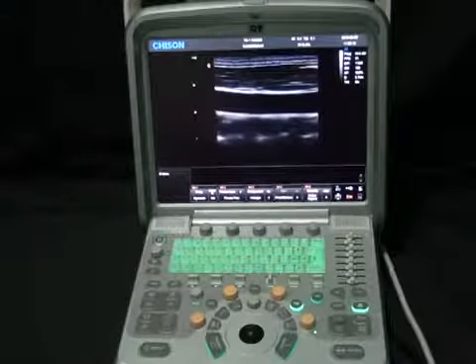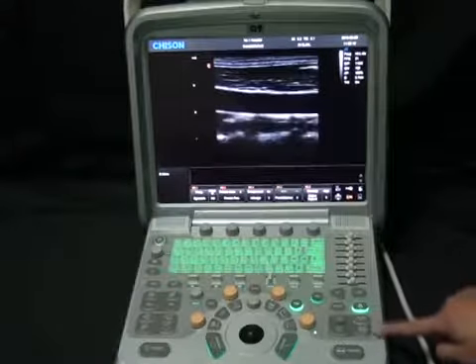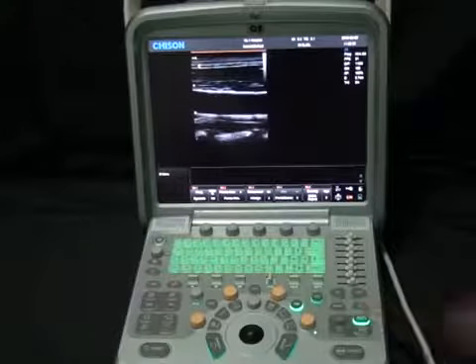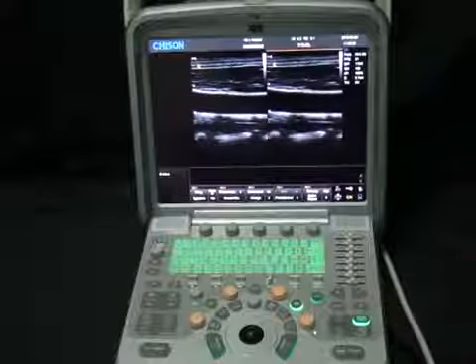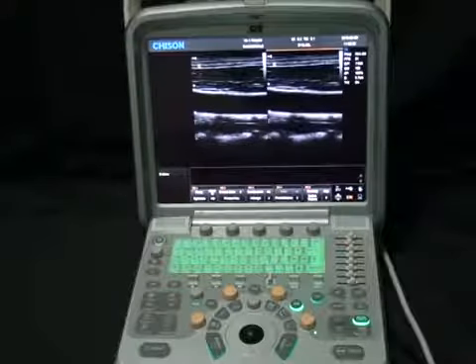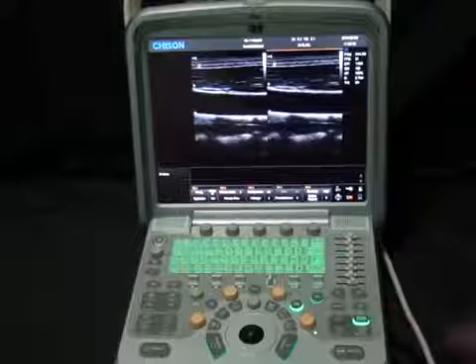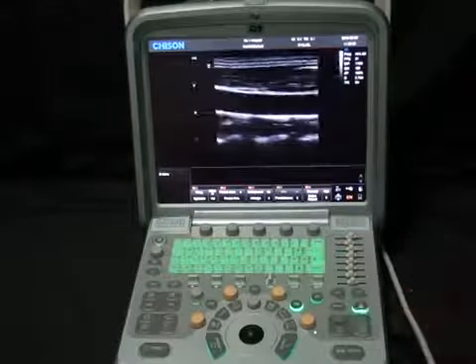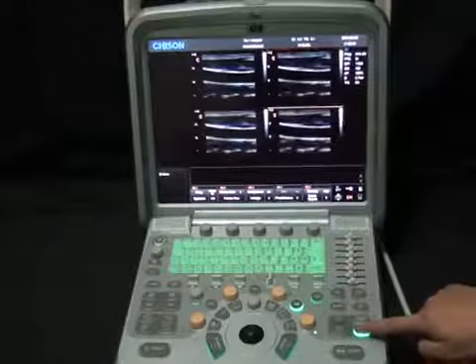It is worth mentioning that we have 2B mode and 4B mode. For example, in 2B mode with split screen, click to make the first image active, push it again and the next becomes active. Back and forth allows you to switch between those. Push the single key to go back to single B mode. The same works for the quad screen.